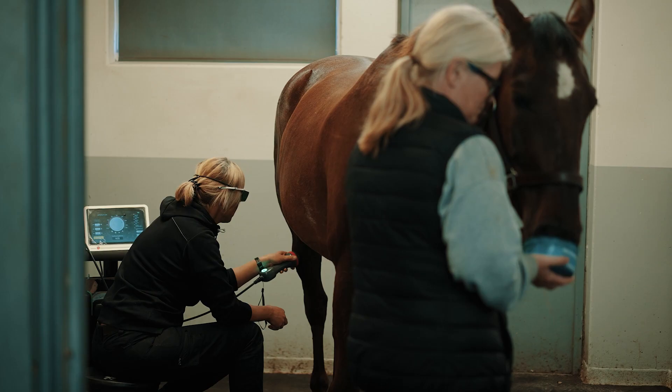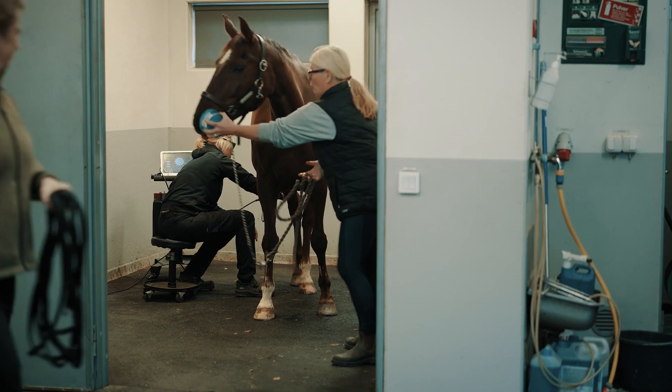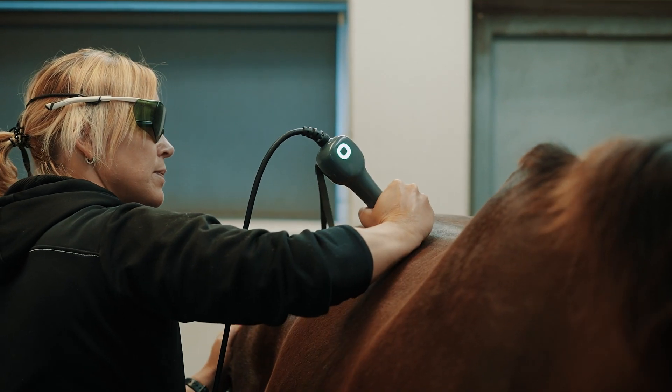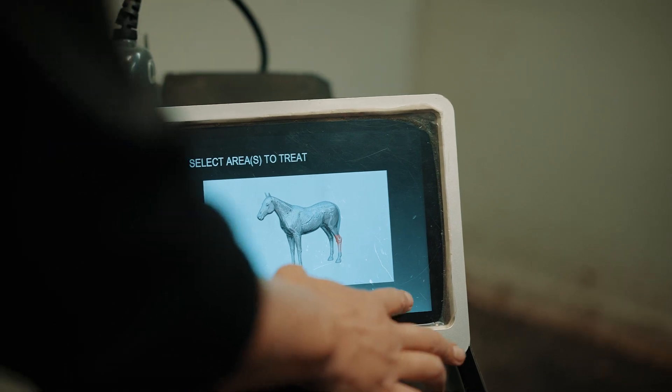It's very easy to use — it tells you exactly what to do and it's not really possible to do it wrong, because it will tell you if something is wrong. If you're using it at the wrong speed it gives a vibration and a different color. With the settings, it's not possible to choose the wrong head.